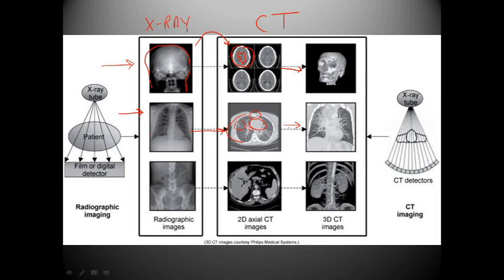coronal image, we can see other anatomy. We can see the pulmonary arteries here. Looks like there's something going on there. And so basically, as you can see, computer tomography has allowed us to view patients to a higher degree and has really increased the amount of information that we have that can lead to a potential diagnosis for the patient.